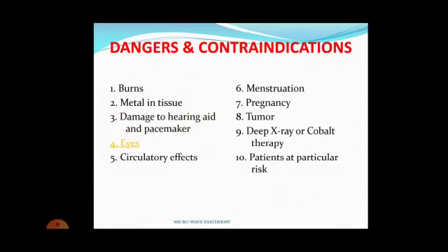Eyes may be damaged, because there will be excessive heating in the intraocular fluid, so eyes should always be covered whenever treatment is given with microwave diathermy. Now, the circulatory effect. Microwave diathermy, by heating, will increase vasodilatation, so definitely there will be more blood supply.